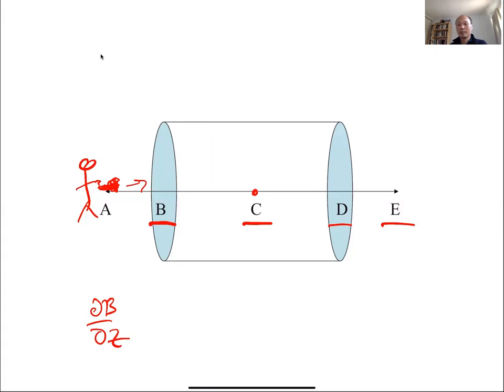So this magnet is symmetric. You mean compared to A or B? Yeah, A is the starting point. So if A is where you are, where is it going to be? That should be E. Yeah. So what's going to happen is this wrench, assuming it's fairly straight, is going to go straight through the magnet and stop right here. So it will go to E.